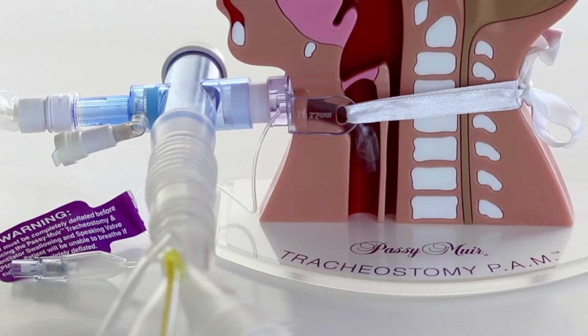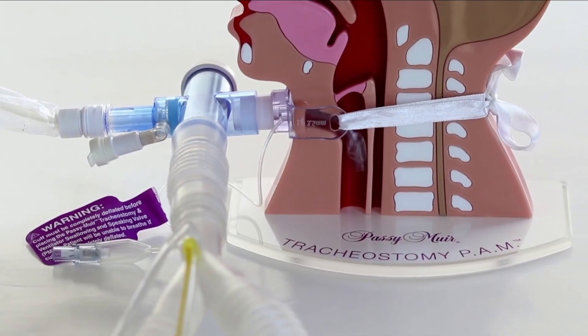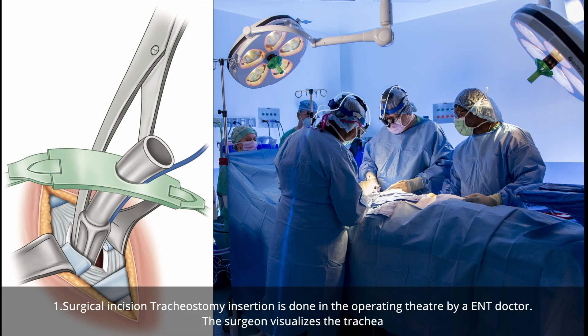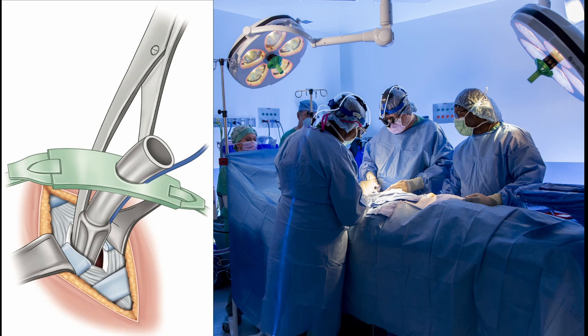Now let's see how the tracheostomy will be inserted. There are two methods of insertion. The first is by surgical incision, inserted by ENT — usually a doctor — in the operating theater, by direct visualization of the trachea.